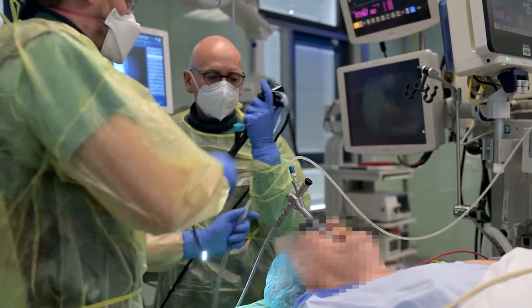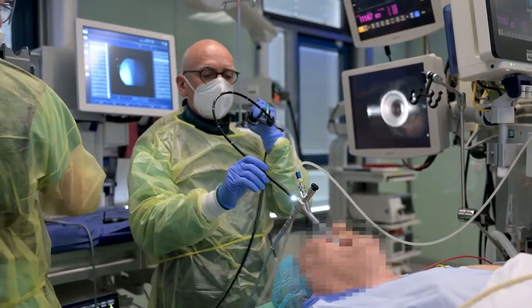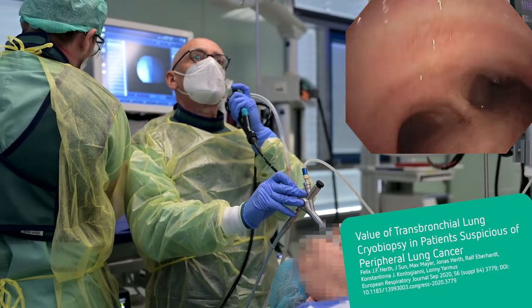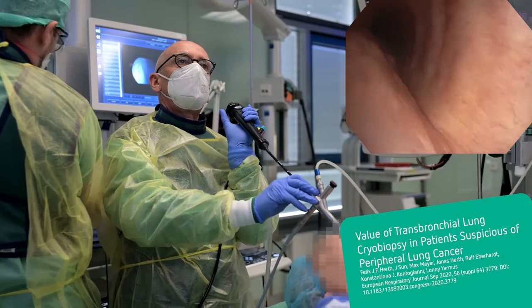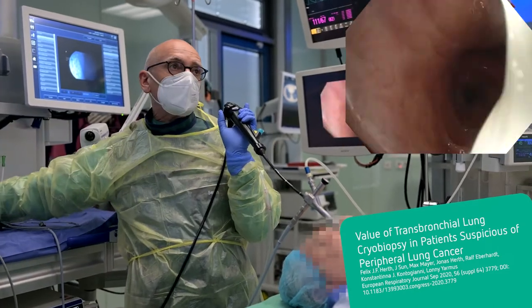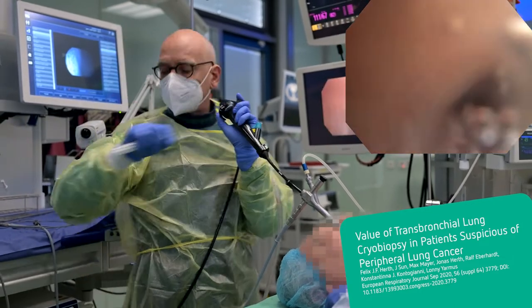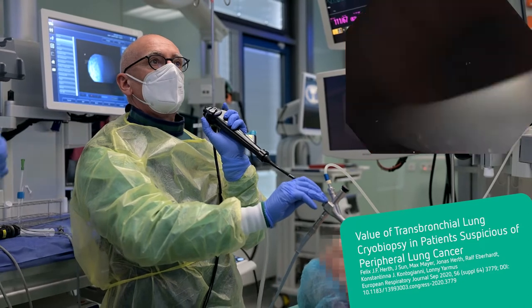The ventilator is connected to the tracheoscope. After securing the airway, the bronchoscope is inserted to inspect it. Moderate bleedings are reported to occur in 6% of patients. In a large retrospective multicenter cohort, 3.5% of patients experienced bleeding that required ice-cold saline or epinephrine injection. The rigid tracheoscope allows for adequate ability to control bleeding in case it occurs.